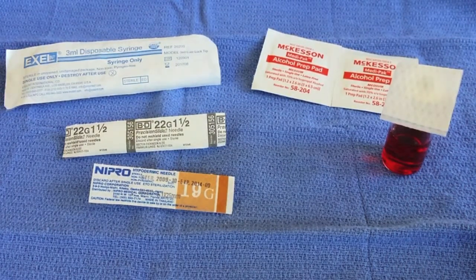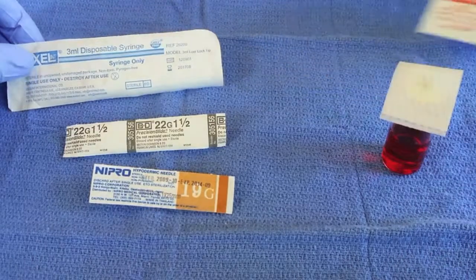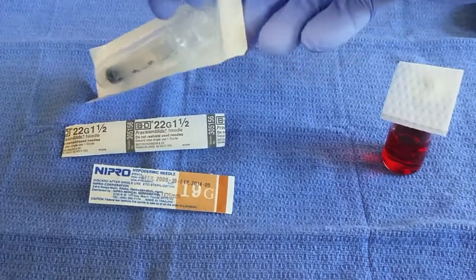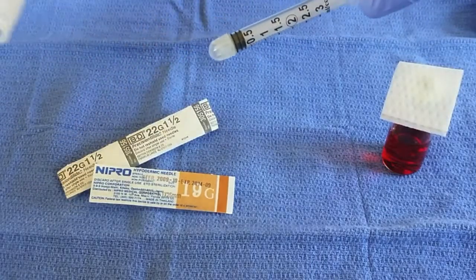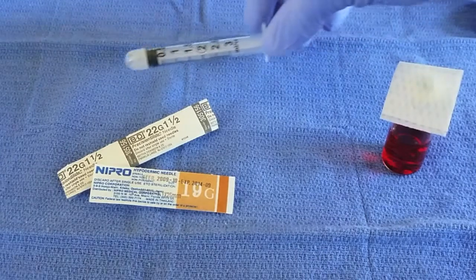First, we will open our syringe. In this case, today we have a 3 ml syringe. I'm going to start by opening the packaging. We have a cap on the end of our syringe, as you can see here. That will keep the tip of the syringe sterile, so we can set that down.